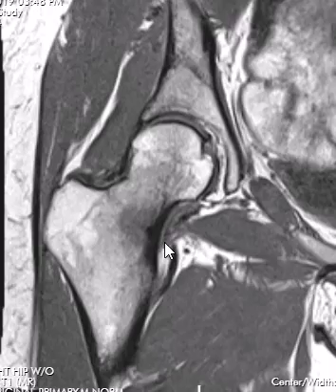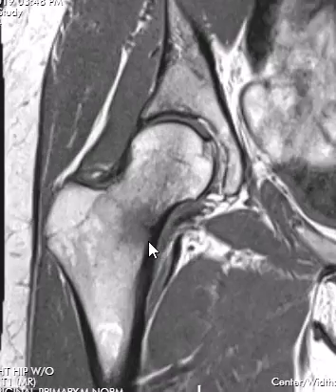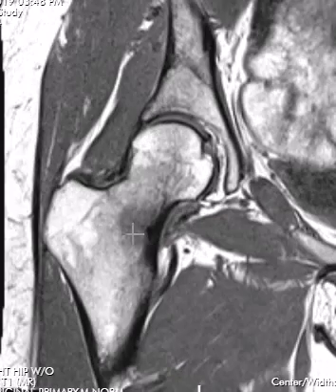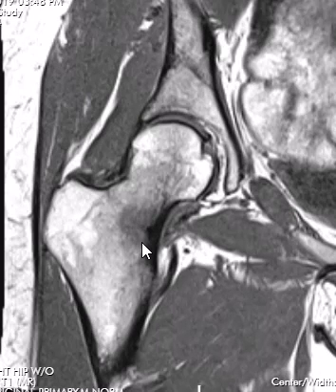Usually they're right along the medial margin of the femoral neck. You see some cortical thickening, maybe a little transverse band of low signal there with a halo of edema, and that's exactly what we have. Often the fracture lines will be a little bit better defined on the T1 images. This one is just a mild, or maybe mild to moderate, stress injury.